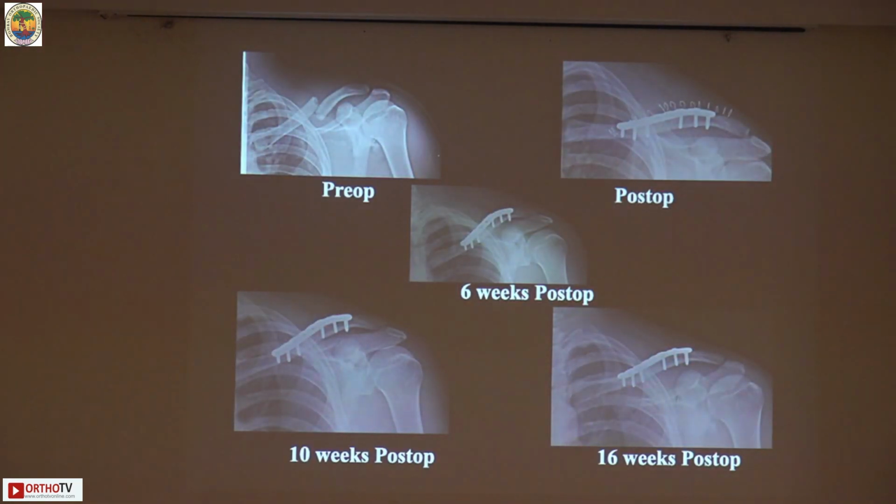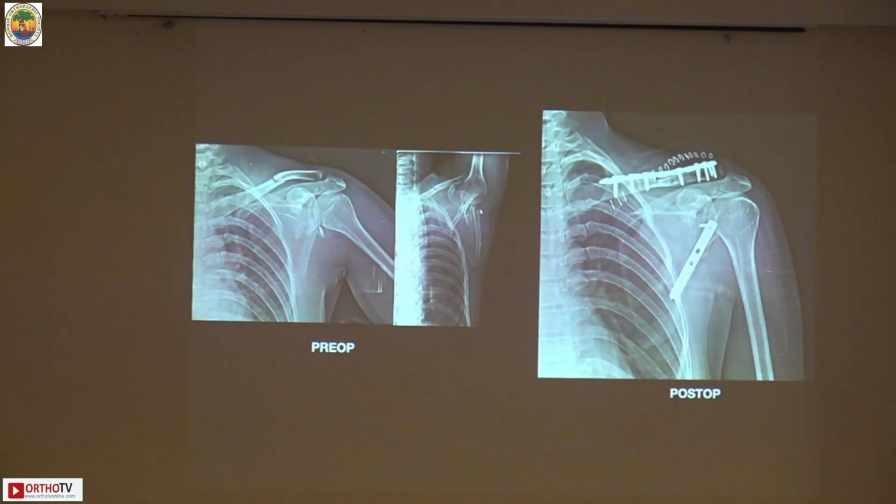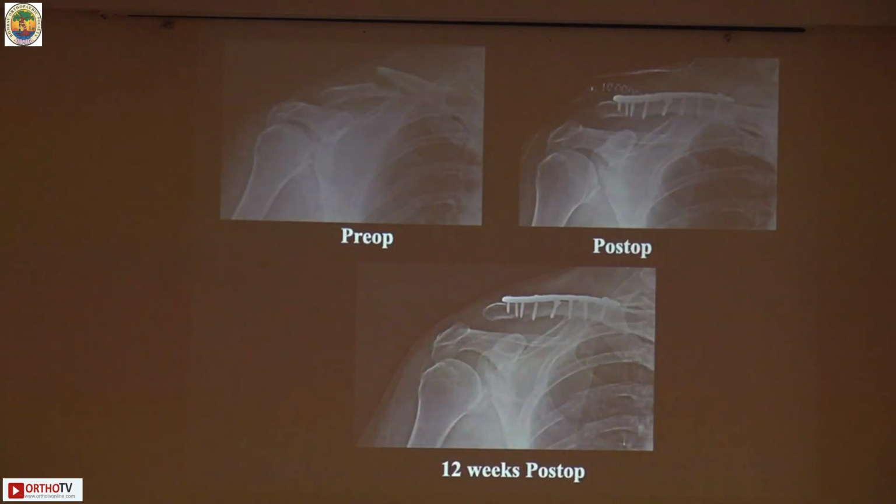A few cases: a 42-year-old male with left clavicle fracture treated with an anatomic plate. In a thin patient, a 4-hole, 8-hole reconstruction plate is used with 2 lag screws. A female patient with scapular fracture and clavicle fracture, floating shoulder, fixed with an anatomical plate and a plate for the scapula. A male patient, a long anatomical plate is used, fracture healed.